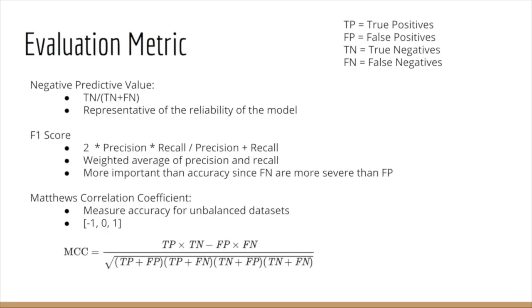We also consider negative predictive value, which is the percentage of true negative values in the pool of predicted negative values. This is an important metric, though we believe it may not be as crucial as sensitivity. High predictive value essentially increases the reliability of the model, by saying that if the model classifies a patient's slides as having no tumor, the patient very likely does not have tumor.